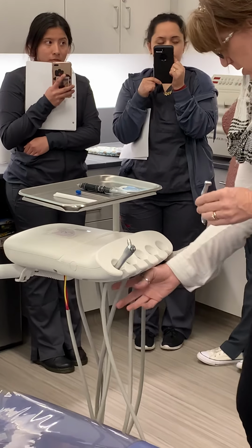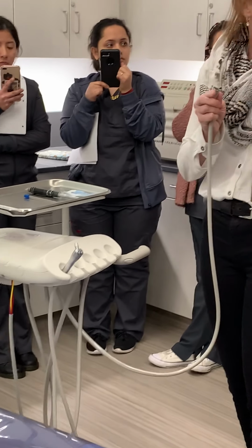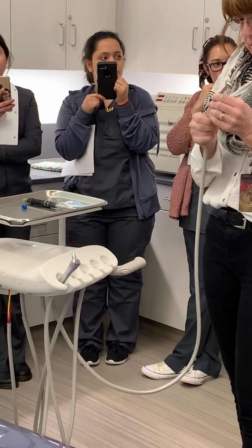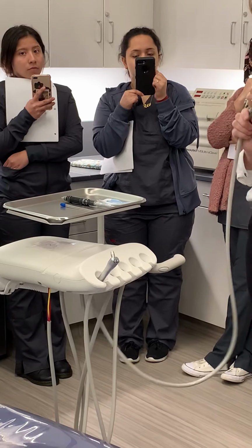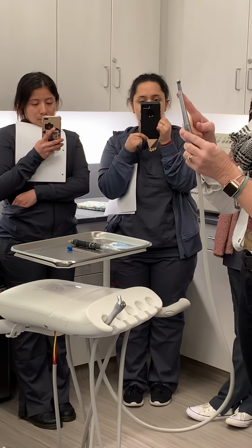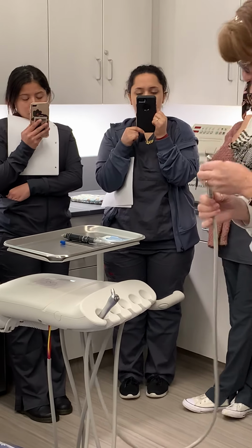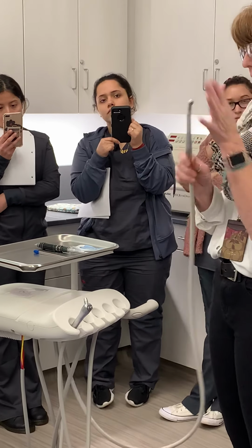So I call it placement 1, 2, and 3. So placement high speed, just so we're saying the same thing. Okay. Because we haven't said that before. So placement 1 is high speed, 2 is slow speed contra, 3 is the straight, if we had both of them on. Okay, so high-speed contra-angle goes in the first hose or the first placement, used by doctor only inside the mouth with or without water. It can rotate at 400,000 RPMs or above.